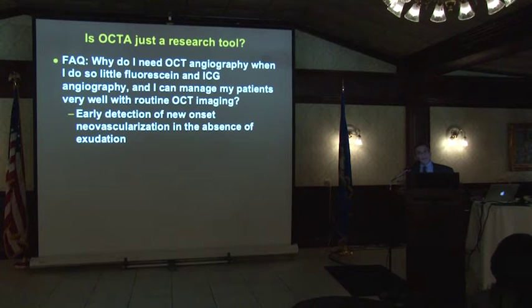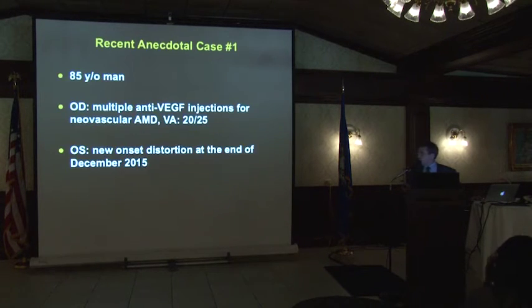One is you're going to identify patients earlier that need your attention. For the first time, we can see these blood vessels coming long before they cause exudation. And even when we're actively managing patients, we're going to use OCT angiography to control how we manage them and get better outcomes. Let me show you a couple recent cases.